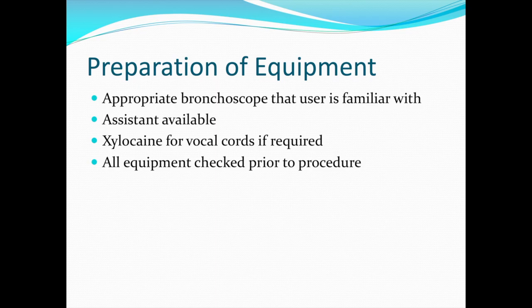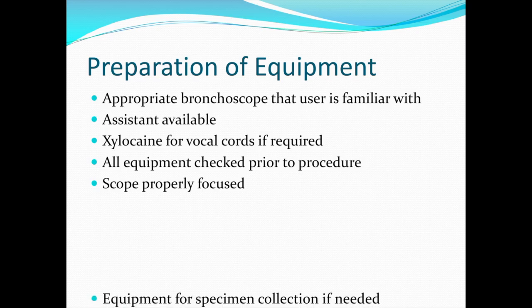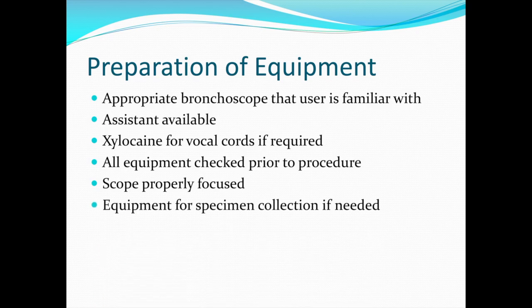Ensure that all of the equipment is checked prior to the procedure and laid out in an easy to use manner. Ensure that the scope is properly focused, as this will help you to get the best images possible during the procedure. And make sure that you have equipment for specimen collection if needed, and in the majority of cases you will require this.